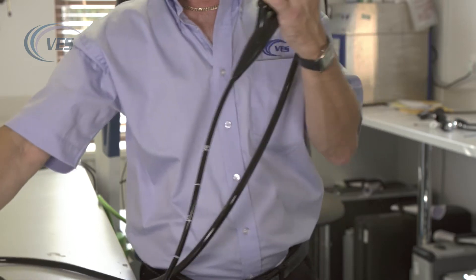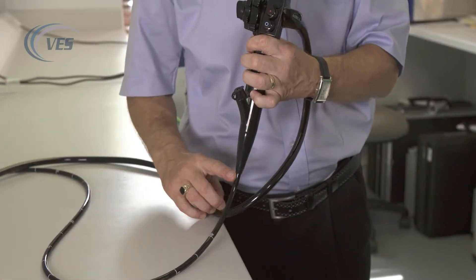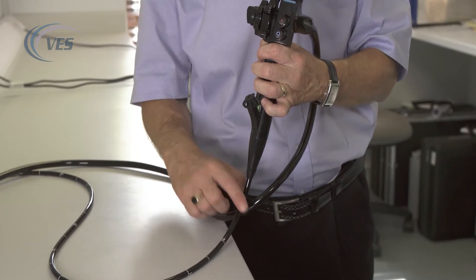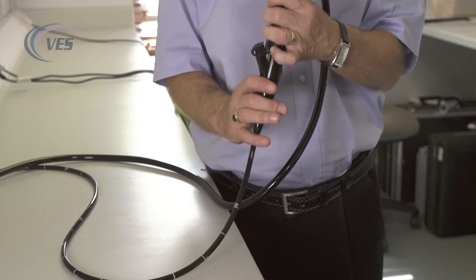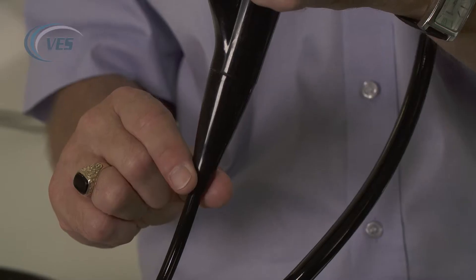If a vet during the procedure becomes tired, make sure that the angle doesn't become too acute. If you see the vet start to do that, just bring them up slightly to take the bend out, which takes the strain off the end of the scope.